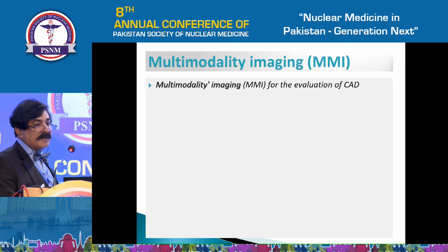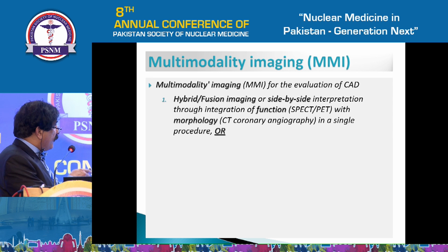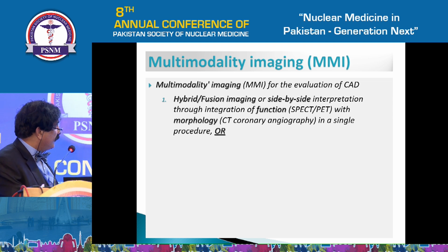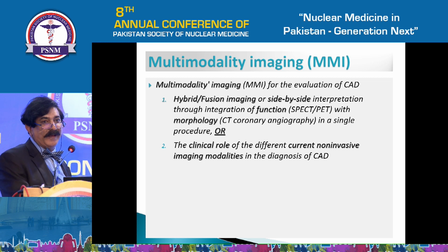So what is multimodality imaging for the evaluation of CAD? It could be hybrid or fusion imaging, interpretation of two images of different modalities for cardiac imaging side by side, through integration of function and structure, morphology like CT angiography in a single procedure, or it could also mean the clinical role of the different current non-invasive imaging modalities in the diagnosis of CAD.